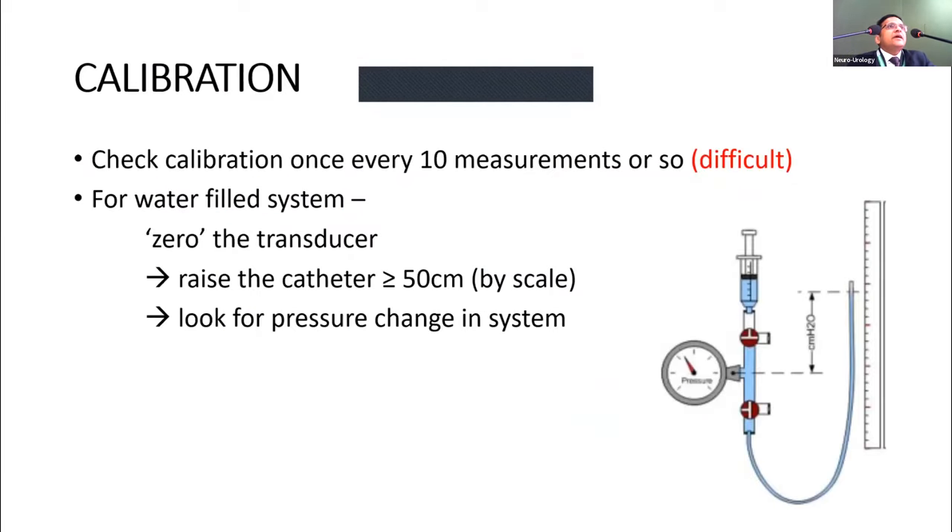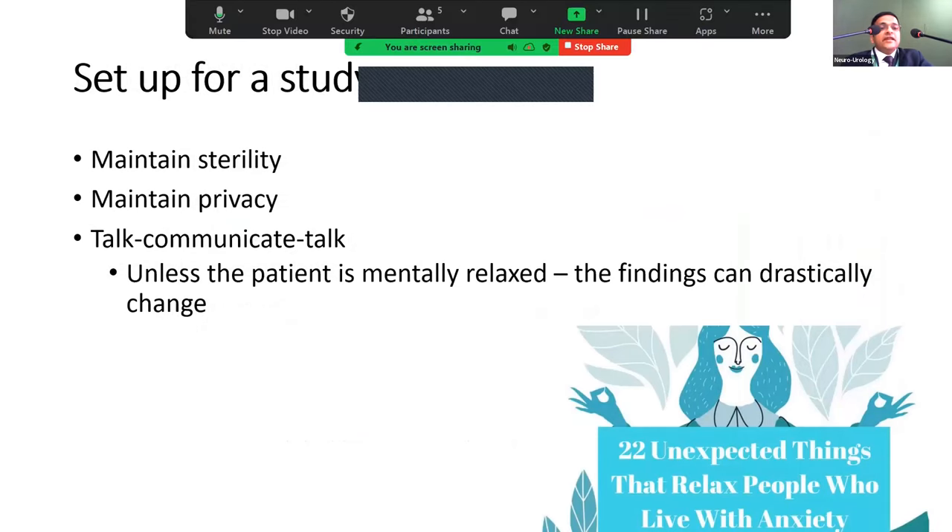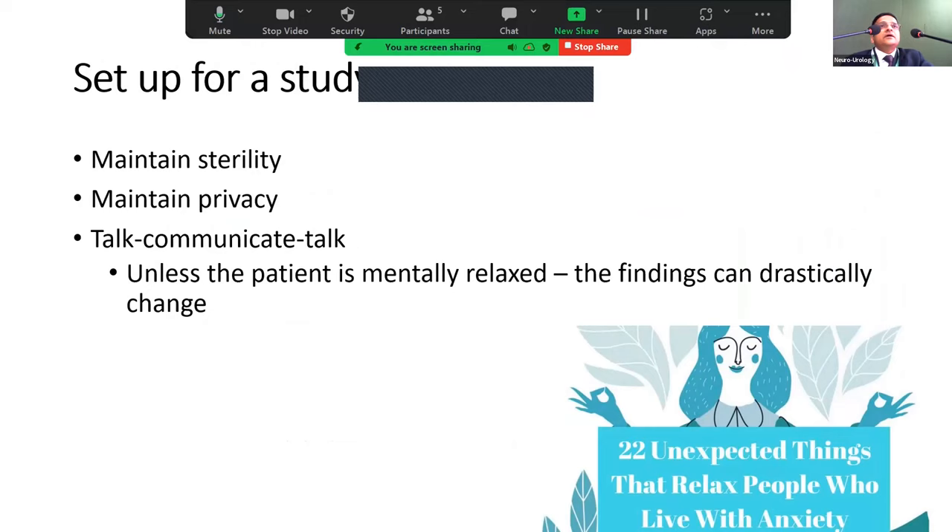For calibration, imported machines have automated calibration, but it is good to periodically check manually. For the water system, simply raise the water column by 50 cm and verify what the machine displays — this confirms whether it is well calibrated.